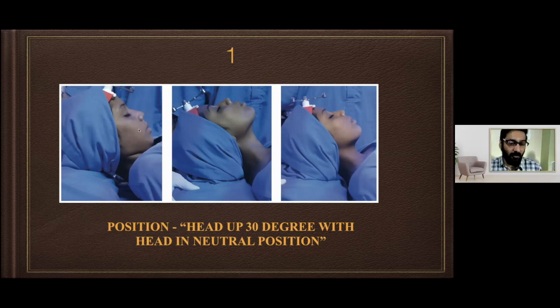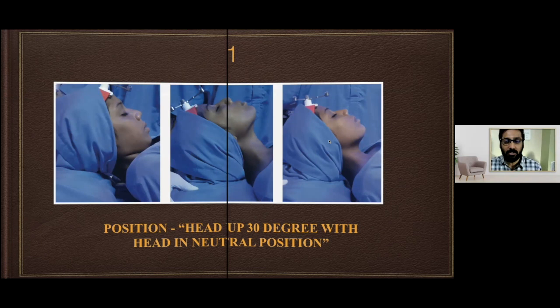If you put it on a frame, you can't do that. If you want to do an odontoidectomy, then you can put the neck in the flexed position. If you want to do anterior craniofacial resection on the frontal lobe, then you have to extend the head. So you can keep changing the head position, and that is a little difficult when you put it on a frame. That's why we don't fix the head when we do skull-base surgery.